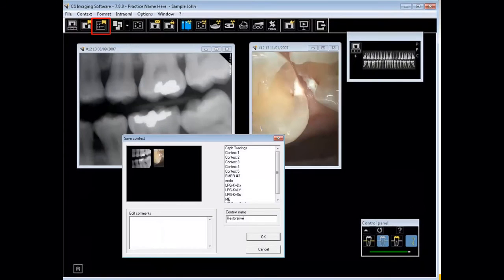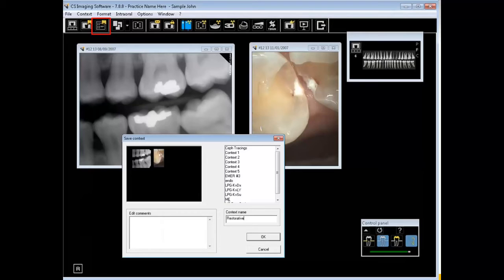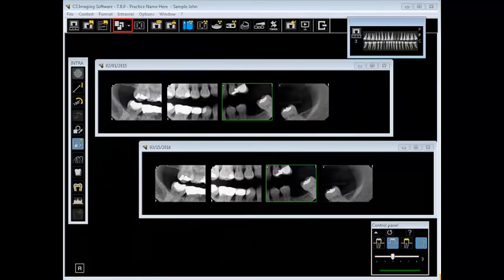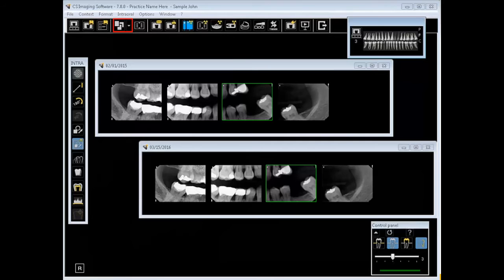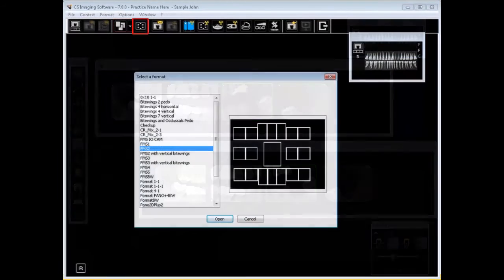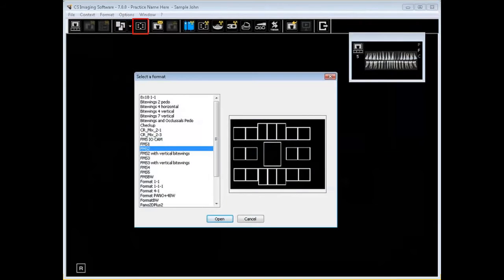Save context is used to save images under one heading. Any image in the workspace, despite its format type, can be saved and retrieved from context. Manual format allows a user to restore down images, in this case in multiple mounts, for side-by-side comparison. You can also utilize manual format to downsize a format and allow capture of an individual image. Use a format allows you to select a format to capture a series of images.